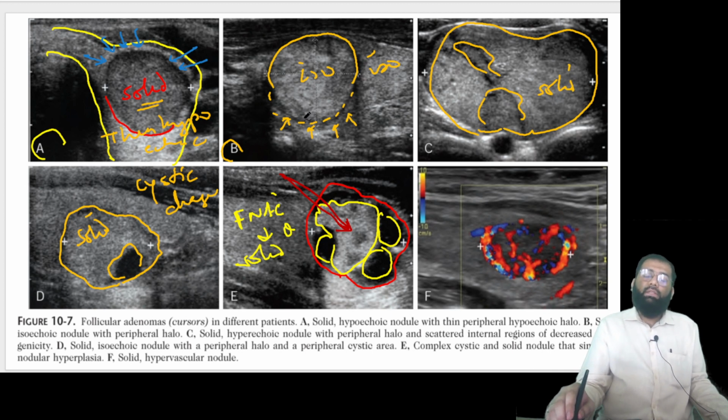But never take risk from the radiologist side or from the sonologist side, because you have to be very careful in such types of lesion with solid components. Okay. Now let us see this lesion. Again, this is a hypoechoic lesion. Whenever it's a hypoechoic lesion, you have to be suspicious. There is increased vascularity in this lesion. So always plan an FNAC. Although this turned out to be adenoma, always have a suspicious mindset in these forms of lesion, which are solid, increased vascularity, or heterogeneous, or a cystic lesion with multiple solid components within it.